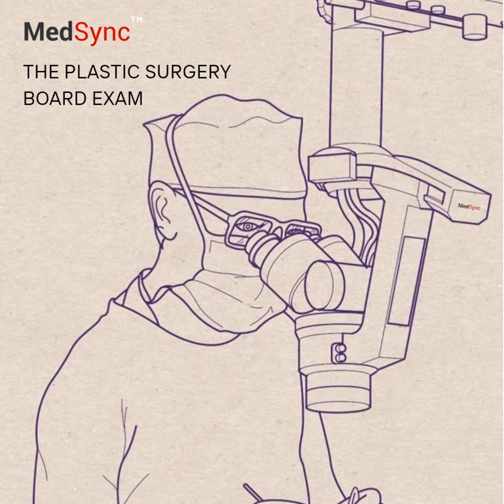Safety is paramount with lasers. What are the key considerations? Starts with proper patient evaluation by the physician. Personnel using lasers need appropriate training and accreditation. Who should perform which procedures? Invasive procedures like full ablative CO2 or erbium resurfacing should definitely be performed by a properly trained physician. Regulations vary by state or country regarding supervision requirements if non-physicians operate lasers. Often, physician on-site presence is required.